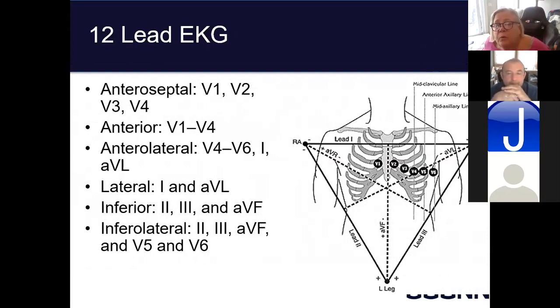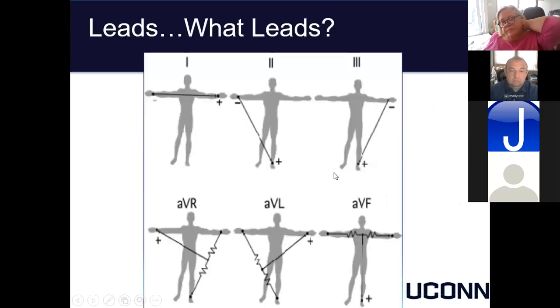If you wanted to see what was happening on the right ventricle, or you had a patient who had dextrocardia as a congenital anomaly, meaning the heart was flipped, then you would have to take these chest leads and reverse them. So V1 would be on the left sternal border, V2 would be on the right sternal border, and then 3, 4, 5, and 6 would go across the right side of the chest. Again, this is just a quick picture of what each of these different leads is measuring.